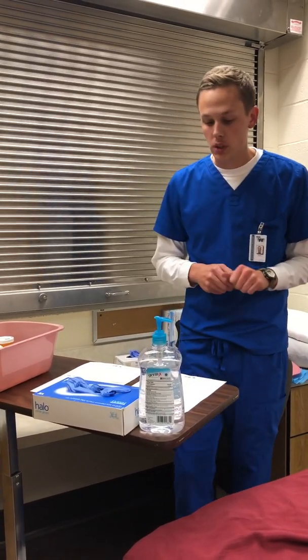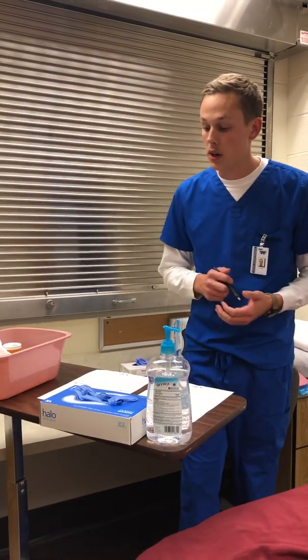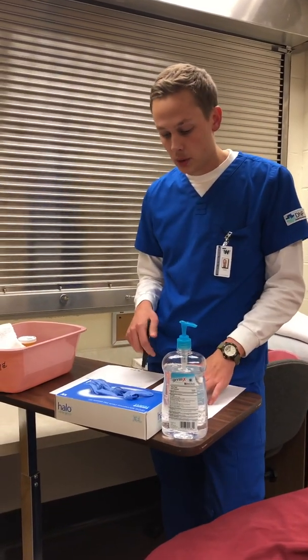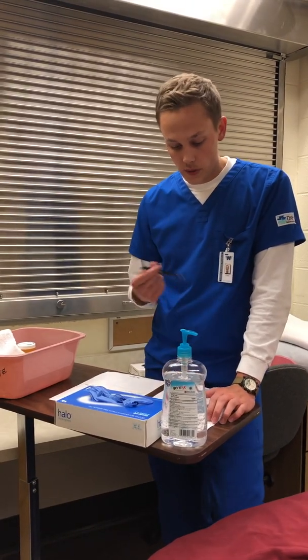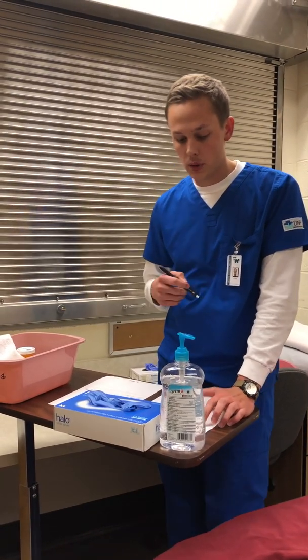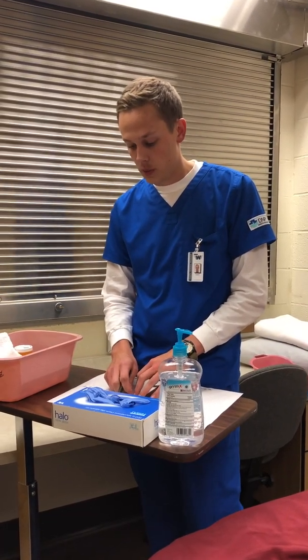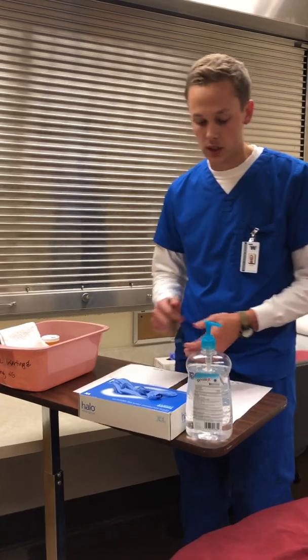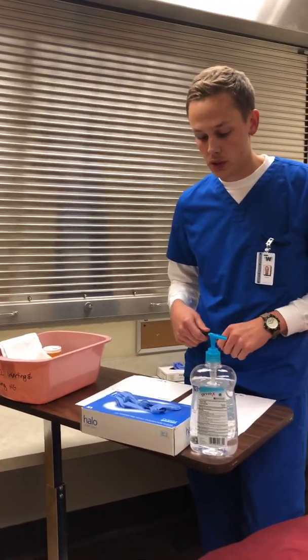So the first thing that I'm going to do is confirm that my healthcare provider orders are the same as my MAR. So right here I have my healthcare provider order and my MAR. On my provider order it says Shirley Coast, 54-year-old female with a date of birth of 5/14/1964, and that matches here on my MAR, Shirley Coast, 54 female with a date of birth of 5/14/1964. So I know I have the same patient's provider orders to my MAR.